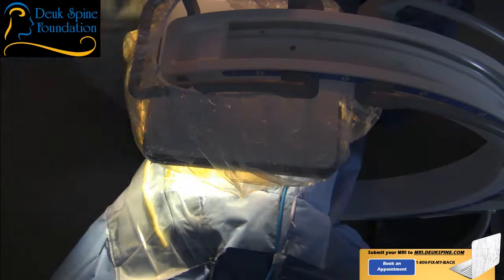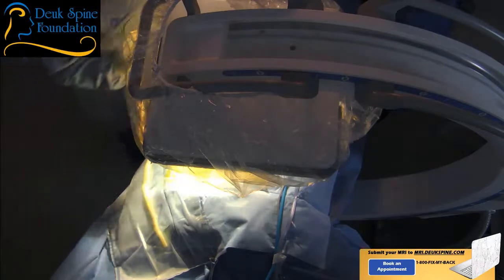Trying to make him as comfortable as... Don't put your hand like that when I'm bringing a sharp bit. You're going to get stuck. That will be bad.